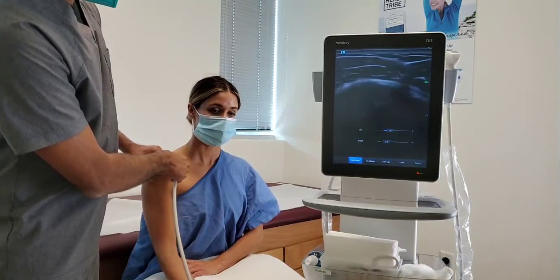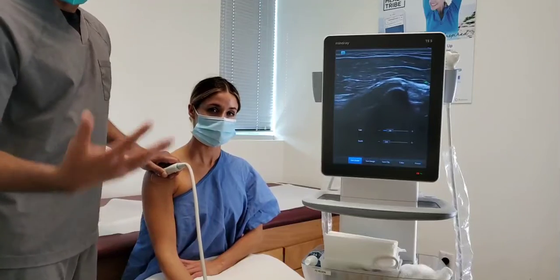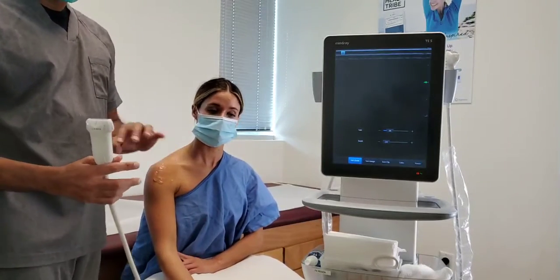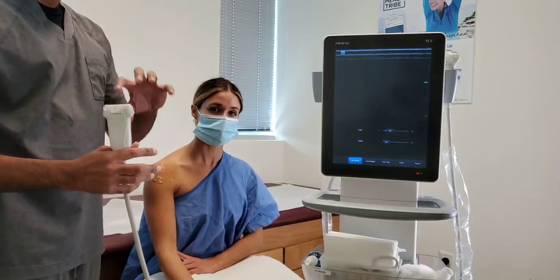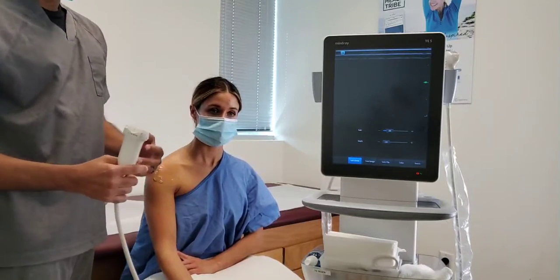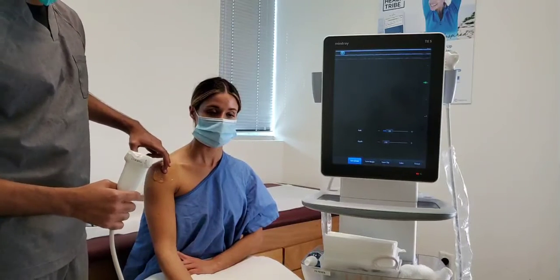Okay? So from this position, I'm going to look at the first part of the rotator cuff. As we discussed in previous weeks, the rotator cuff is 4 different tendons that are almost continuous, come around and wrap around the ball of the ball and socket joint. And those tendon fibers, there's a part of the rotator cuff that's in the front called the subscapularis.